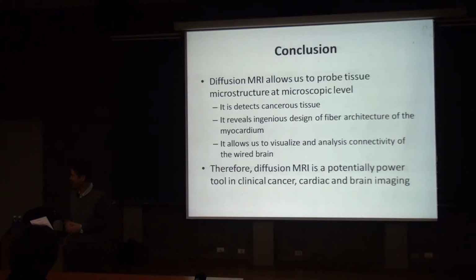I have a question. The fiber you are talking about, what's its relation with what we know as neurons in the brain? Is there any connection at all? Okay. Yeah, this is also a very good question. Actually, from the bottom up, if we look at the microscopic sizes, we will see neurons, and then we will also see the axons.